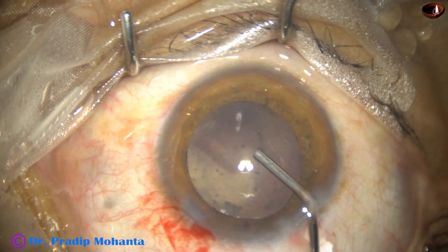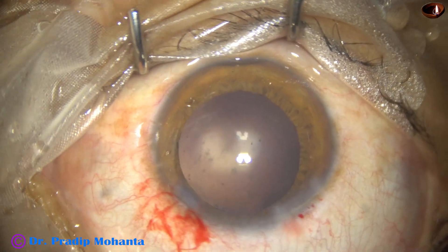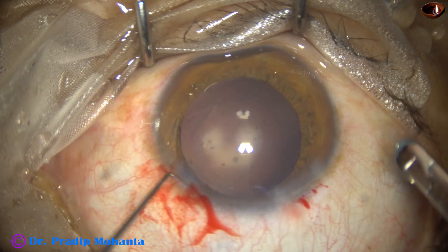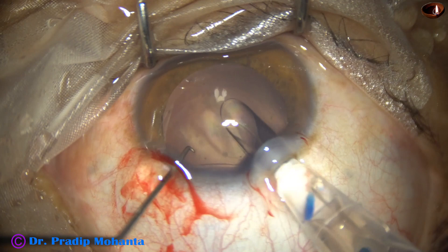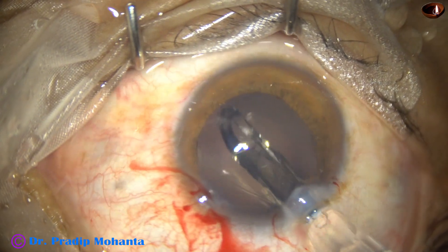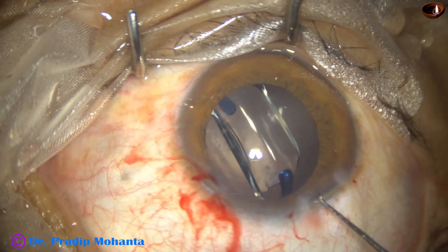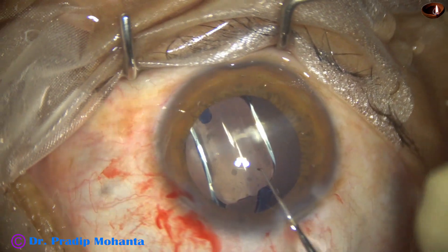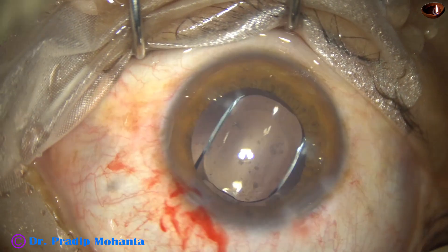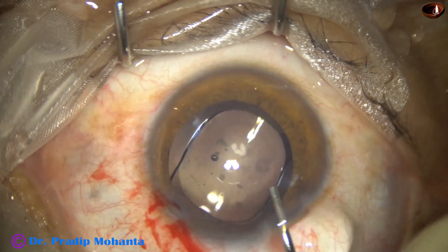Now I inject visco. In this case we have selected a Hoya single-piece monofocal intraocular lens, model ON50 — no financial interest. The lens is oriented with haptics about 90 degrees away from the main incision so that I can go easily behind the lens and remove the visco between the intraocular lens and the posterior capsule.